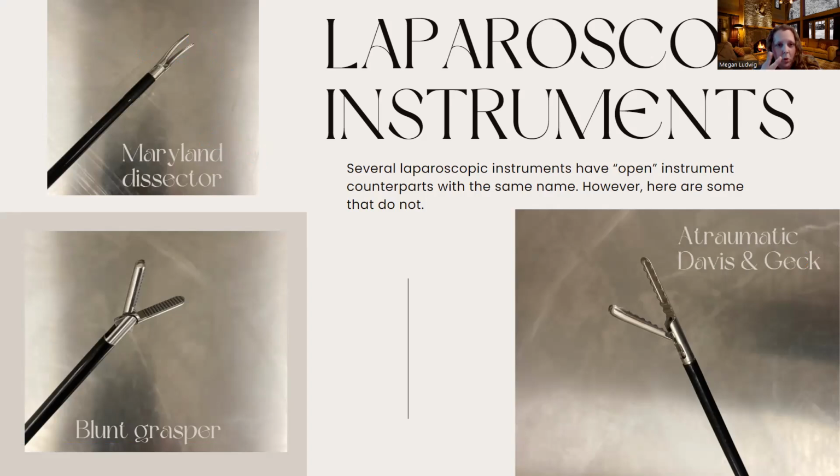And what they're going to do is actually open up the ends of those dissectors. So they're spreading them open to get through tissue. We call that blunt dissection. So you don't have to use scissors to get through or push through tissue. You can use a Maryland dissector.